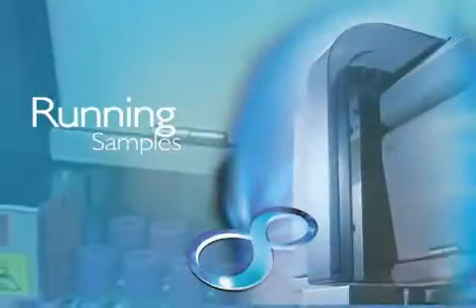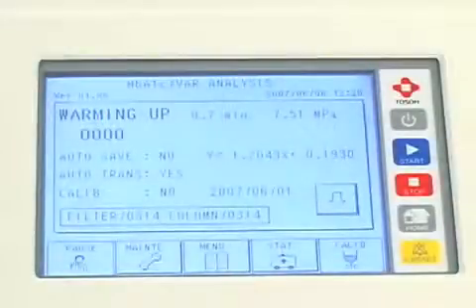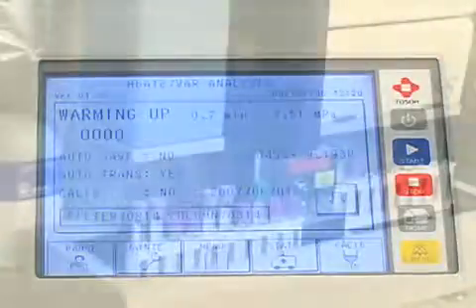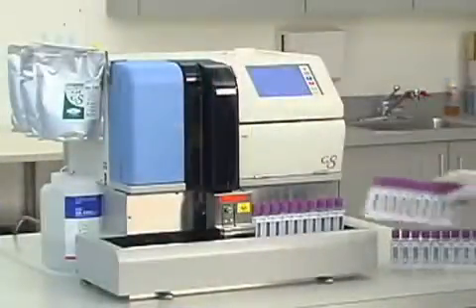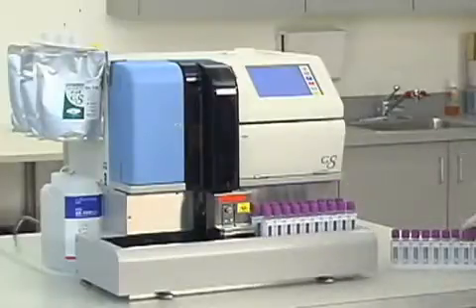After a brief warm-up, the system is ready to run samples. To load samples, the operator places closed primary tubes directly on the system. Cap-piercing and barcode identification are done automatically. No sample pretreatment is required.